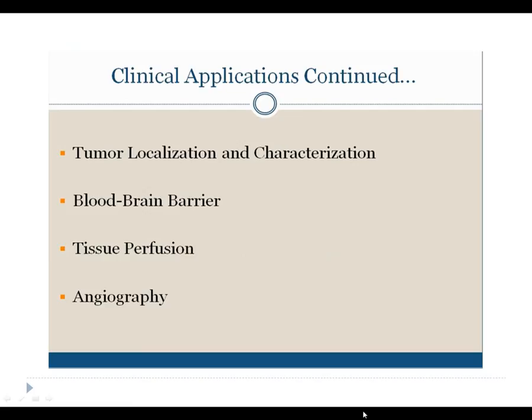Perfusion techniques combine contrast administration with a very fast image acquisition. Perfusion techniques can show blood flow, blood volume, and tissue perfusion of organs such as the brain and the heart. A bolus injection with fast imaging techniques in MR angiography can show arterial and venous flow. The MR contrast agent increases the signal from blood in T1 weighted sequences.